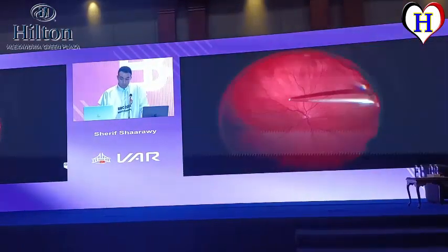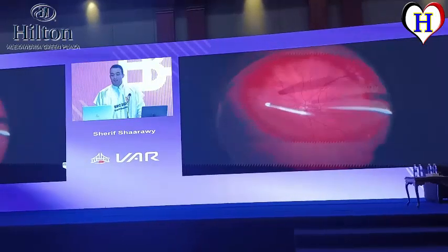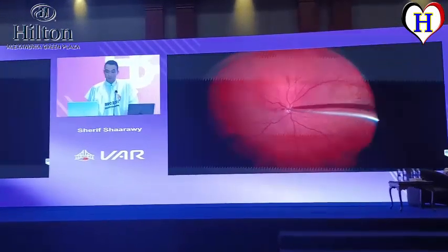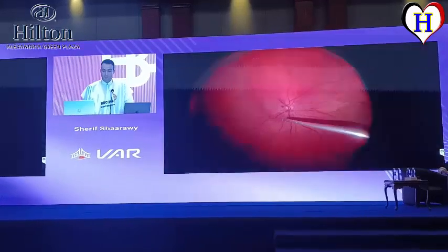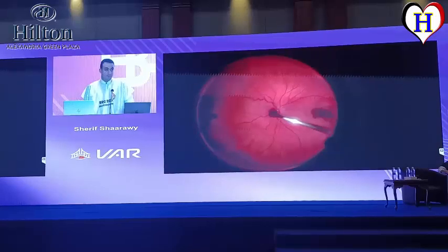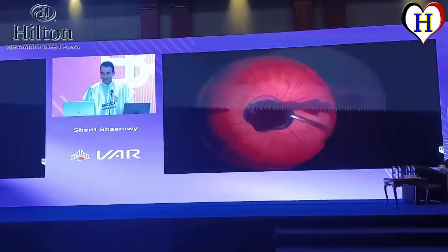Started with a routine vitrectomy, started PVD induction. As soon as I started PVD induction, you can see the hemorrhage at the disc. There was no touch or anything, it's just the vitreous moving, and now taking the rest of the posterior hyaloid, lifting that up, and again the bleed actually worsened. Started to stain to start my peel.